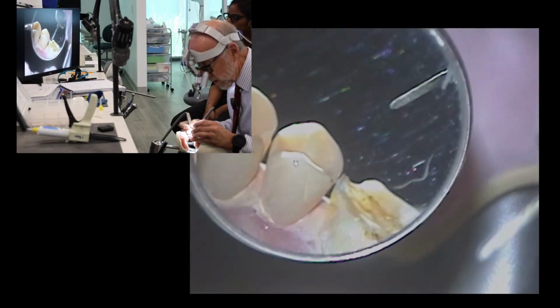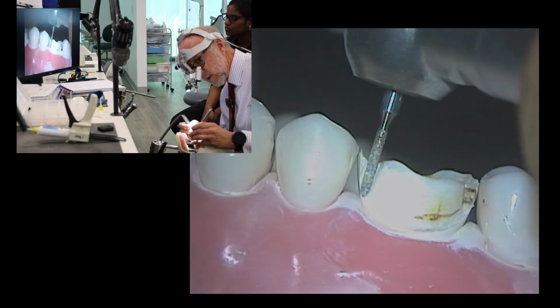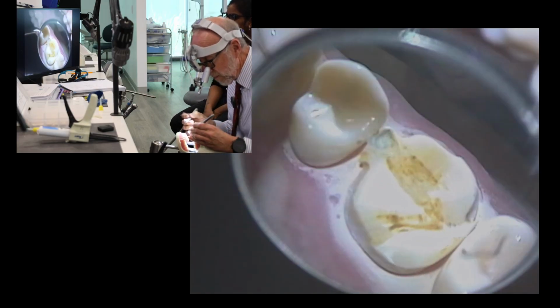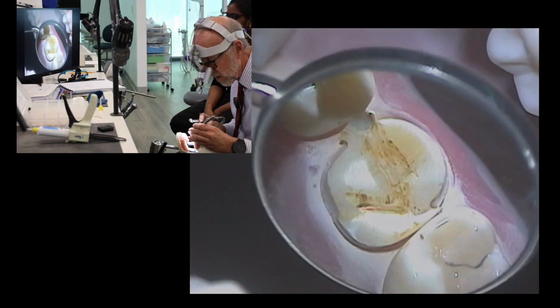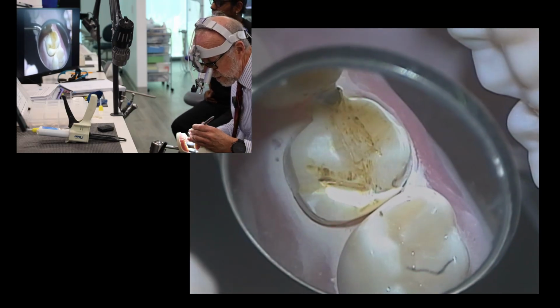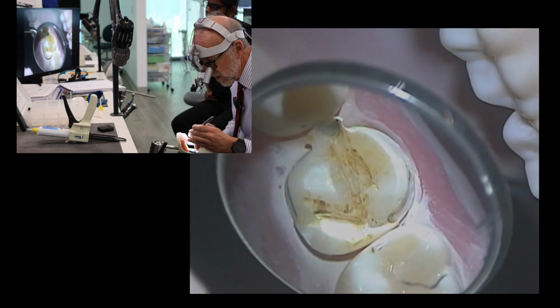And then just walk this through from the lingual, walk it through from the buccal. I can look this way and come through from the buccal. I can lean in a little bit and use the mirror and take it through from the lingual. Do both, and then you'll have the most control over what's happening on that mesial side there. Okay? All right. So do the distal half, like I did the mesial half.